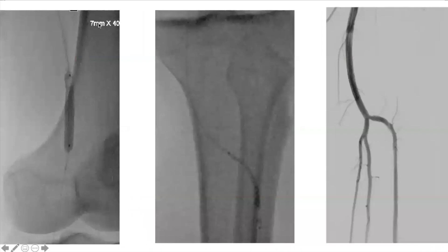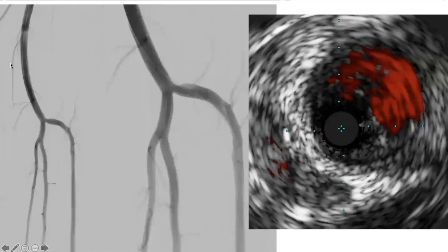One reason IVUS has real benefit is that all of us have been using bigger and bigger balloons all the way into tibials, partly because we feel better having measurements from IVUS. Knowing the disease is more severe, I used a 7mm AngioSculpt balloon in the distal and mid popliteal, then ballooned in the AT. Everything looked much better, but I didn't really like how the AT looked.